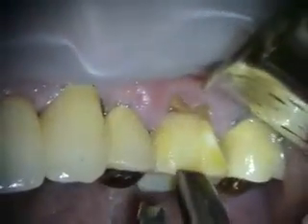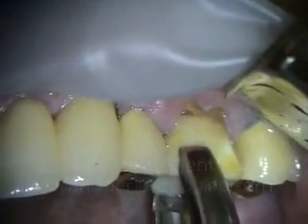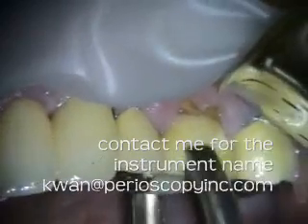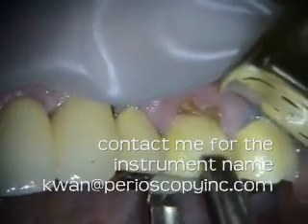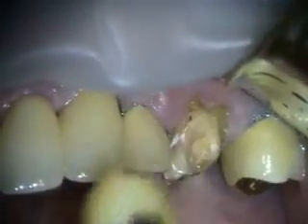And we have these temporary crown removers. It's made by some guy in General Dentist, I think, in Texas. And you grab the provisional kind of near the occlusal. Comes off easily.